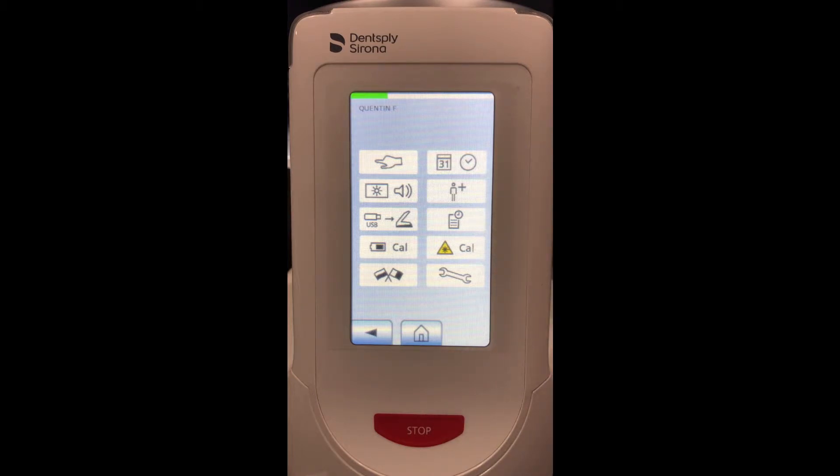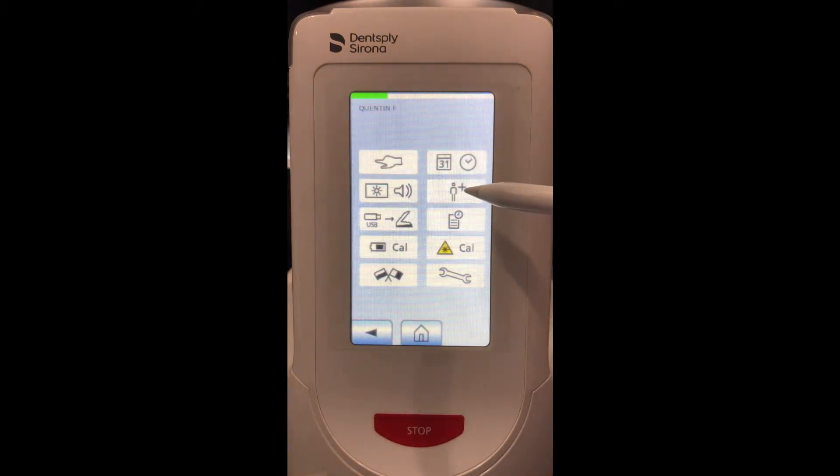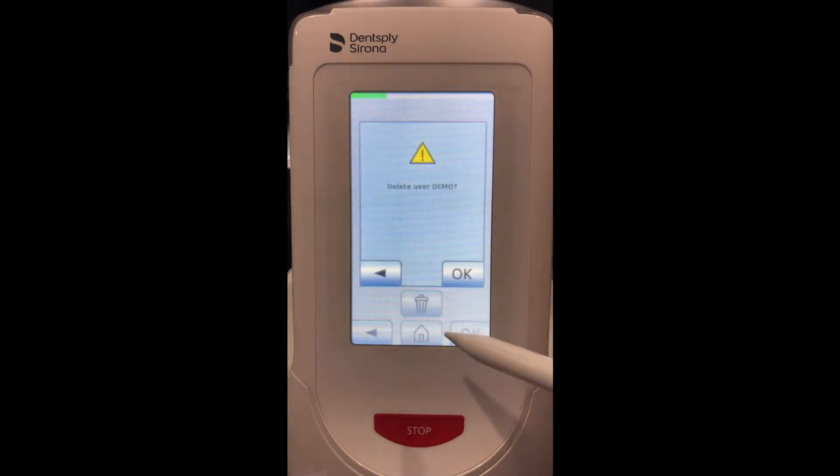All of these different settings will be ones you will activate if you are doing any maintenance of the laser or working with our technical support team, so I won't go over them at this time. You can also change the date and time of your laser, as well as add users, which I'll show you how to do now.